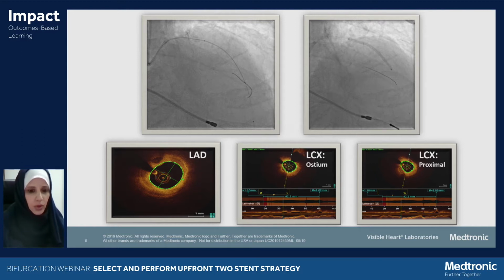important to do OCT for him and see how much debulking or atherectomy and how involved this process was going to be. So to my pleasant surprise, when we did the LAD, there was minimal calcification. And so we ruled out any role for atherectomy devices and debulking in this patient.